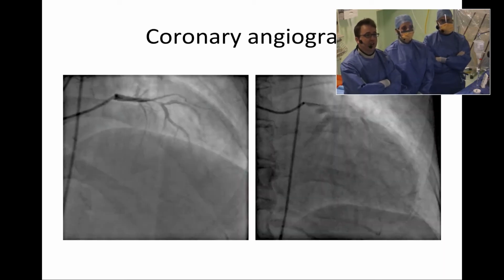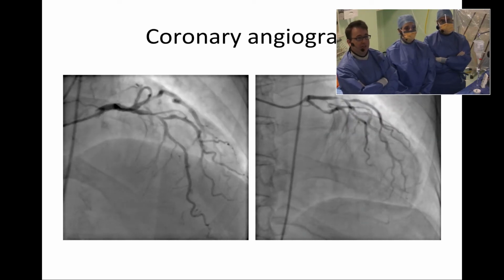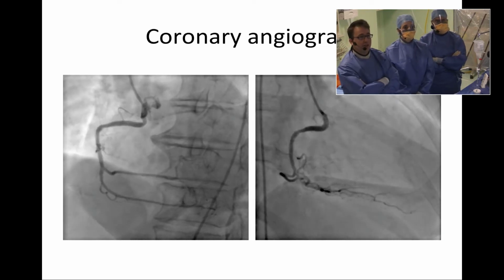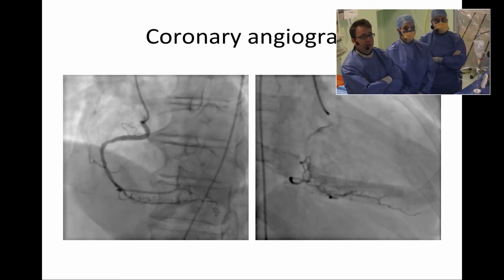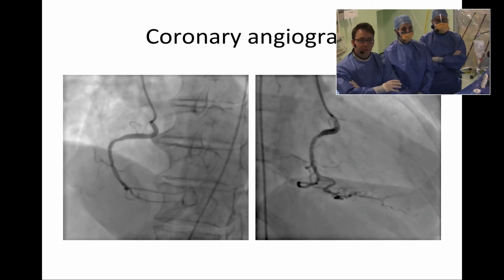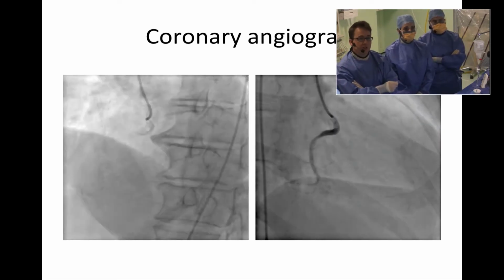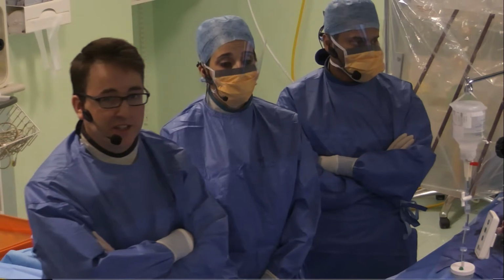And if we move ahead now to look at the right coronary images, or there's some more of the left there, so just highlighting the disease along the course of the LAD, you can see there's also some disease in the right coronary artery as well. So if you had a way of revascularizing patients without using physiology, it's likely in a case like this you may end up implanting many stents in the LAD, a stent in the circumflex and a stent in the right coronary artery.